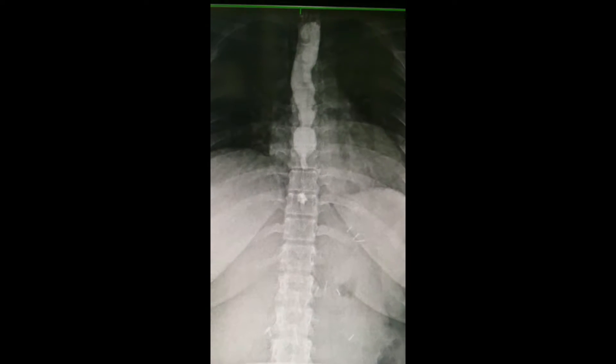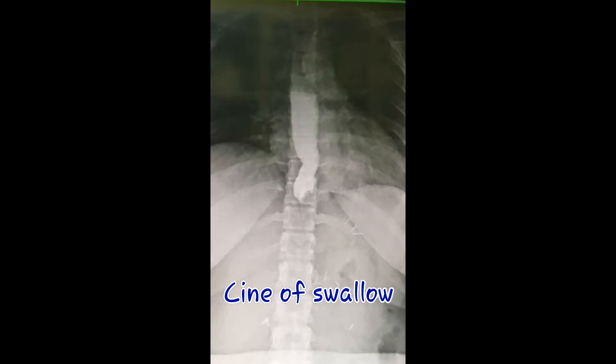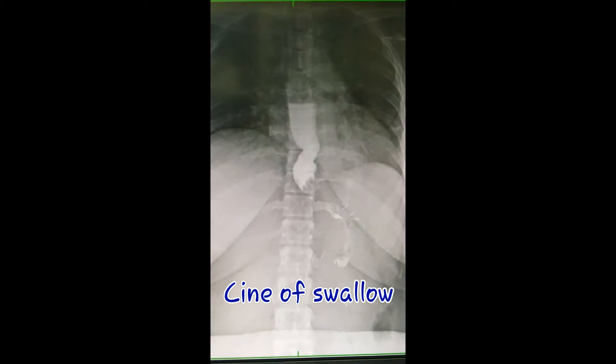Barium or gastrographin swallow is a special radiographic examination of the oropharynx, esophagus, stomach, and duodenum — the first part of the small intestine. We use barium sulfate or gastrographin as contrast media to visualize parts of the body using fluoroscopy and cine, a type of X-ray imaging.